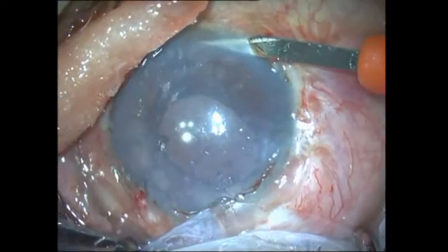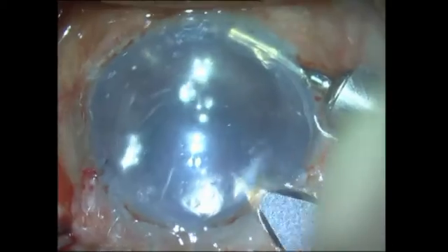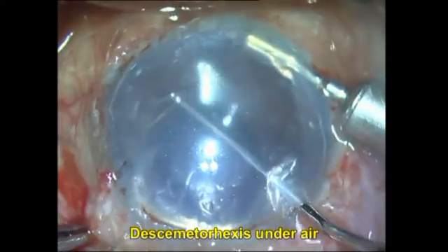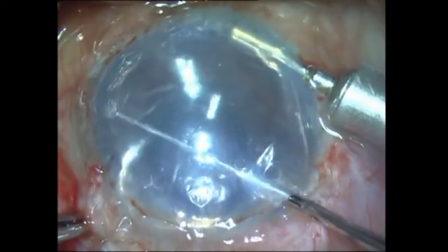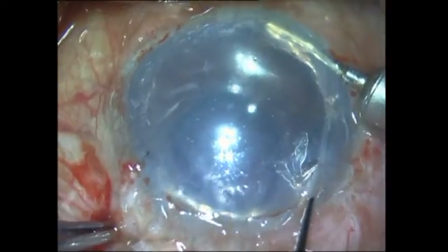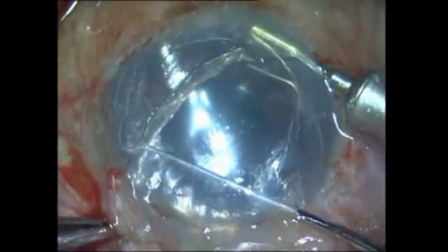Once we have stained the graft, we turn our attention to the patient's eye. I insert an anterior chamber maintainer for my technique of air pump assisted PDEC. The ACM is connected to the air pump and is continuously infusing air into the anterior chamber. Desmetorexis under an air bubble has been described by Tan et al., but what I am doing here is using pressurized air infusion, which gives better visibility.